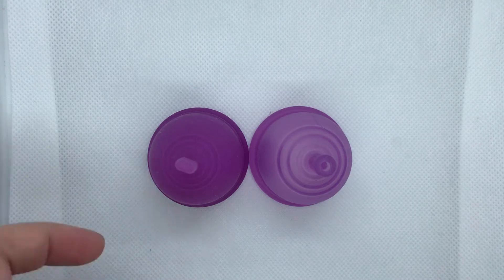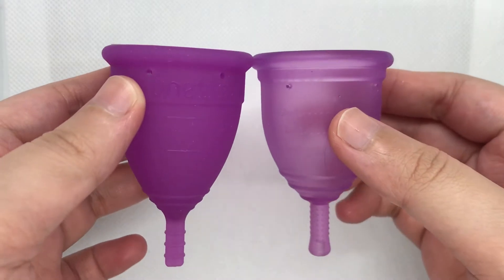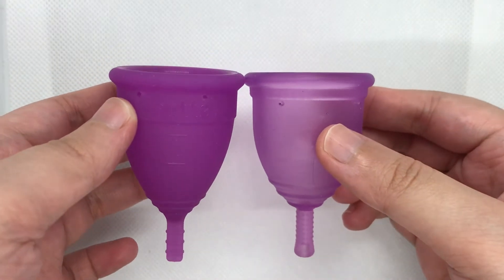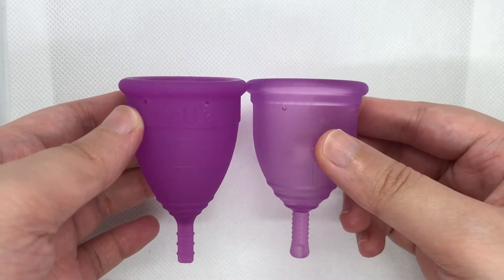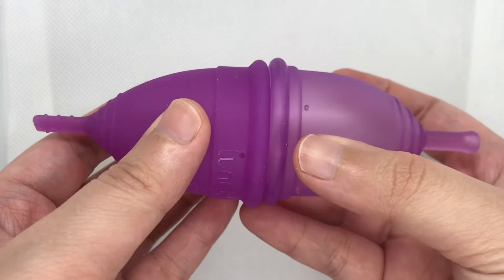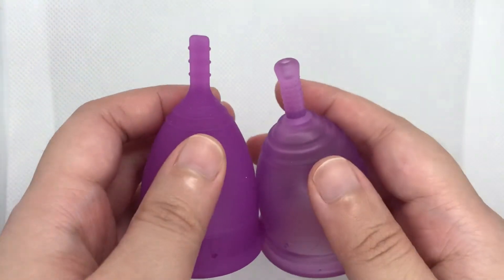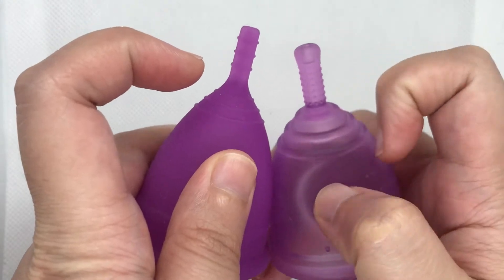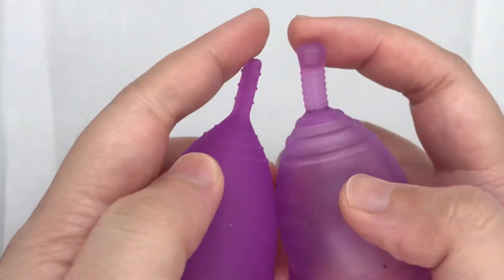Here's a video comparison of the Lunette in Model 2 and the Ruby Cup in size medium. Here are the lengths, diameter, grip rings, and stems.